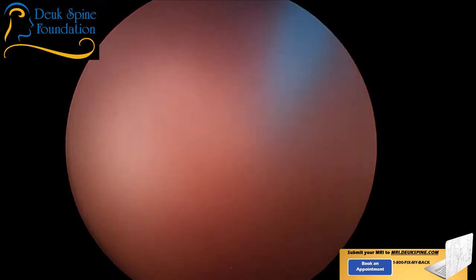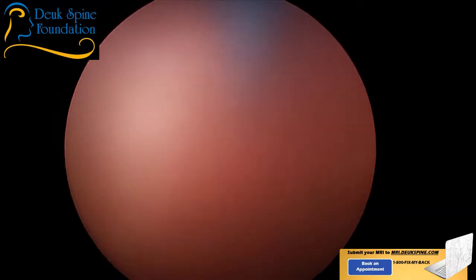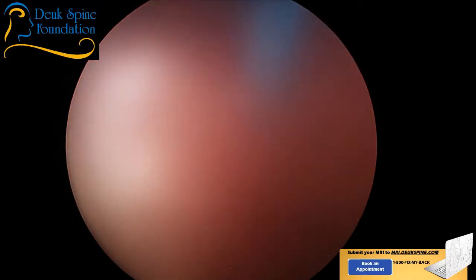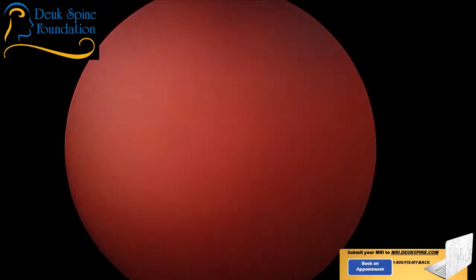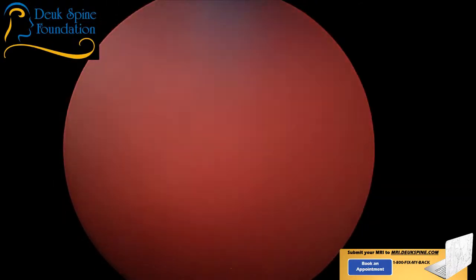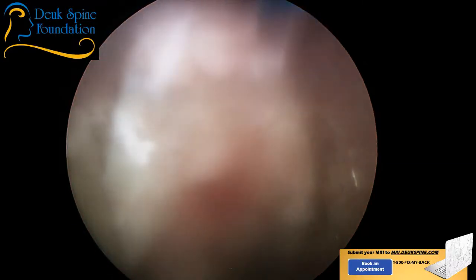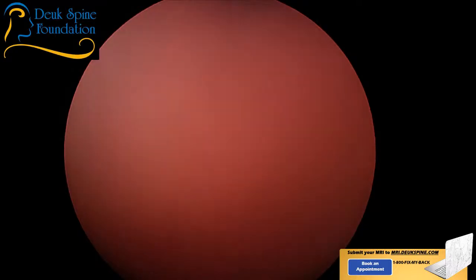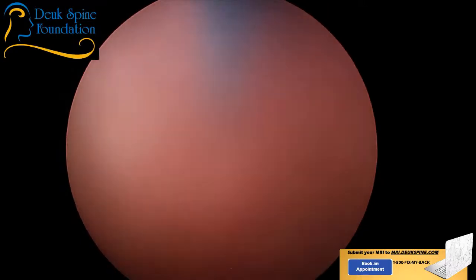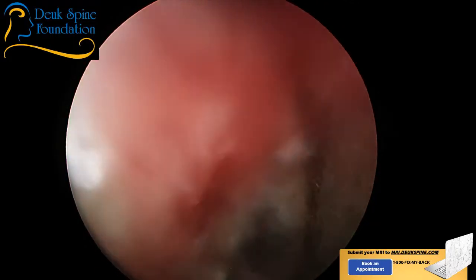You know, when you're walking through the jungle in the Vietnam War and you're in the United States military, you're carrying a gun, and it's nice and calm and quiet, you walk slowly. But when people start shooting at you, you start running. This is when it's bleeding like this, you don't walk, you run. So this is time to move quicker. Not the nice, calm, slow handoff. It's a quick handoff, so that I can get there before the view goes away.